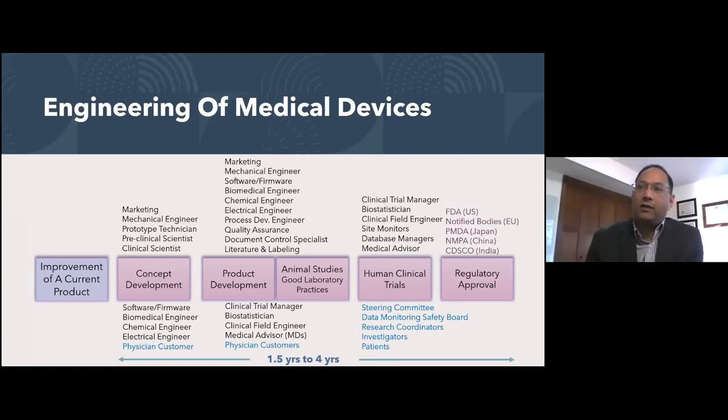Actually, real mitigation is during development. Okay. In verification, sometimes you use independent agencies, independent companies, where you send the product out and have them try to break it, try to hack it based on their technology, based on what they know and what they're used to. Because security issues can be not only at the firmware or software level, they can be at the hardware level as well, right? So you sometimes engage other agencies to do some kind of testing so that you can incorporate that even before it goes to the verification validation stage.